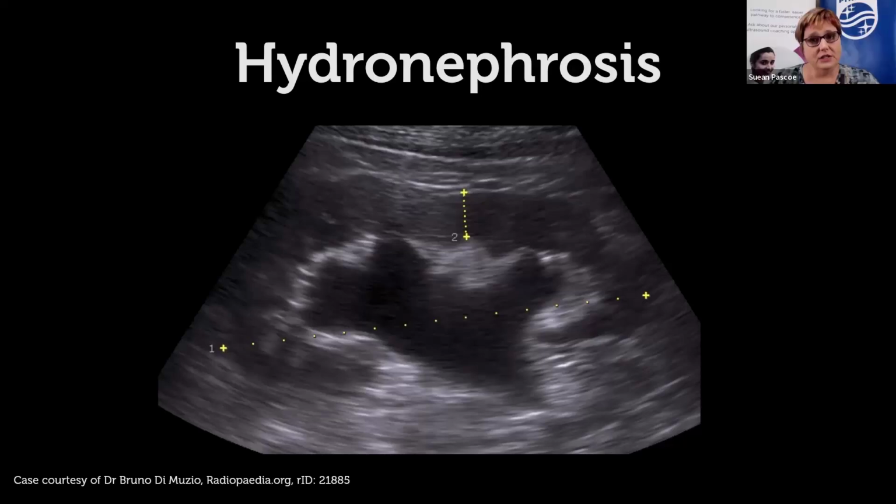We then get our patients to go to the bathroom and come back to look at their post-micturition volumes of the bladder and to demonstrate whether there is any urinary retention. Then we go up and look at the kidneys. And I guess my scanning technique has evolved like that because it's just one stop. You don't have to scan everything over and over again.